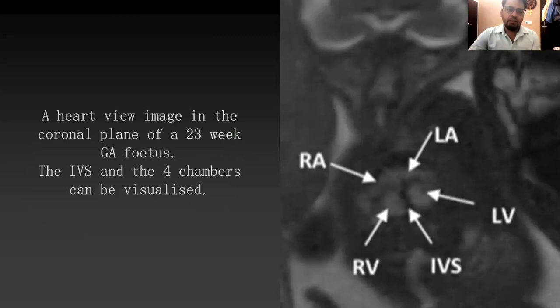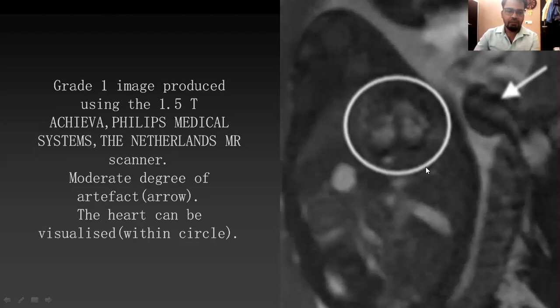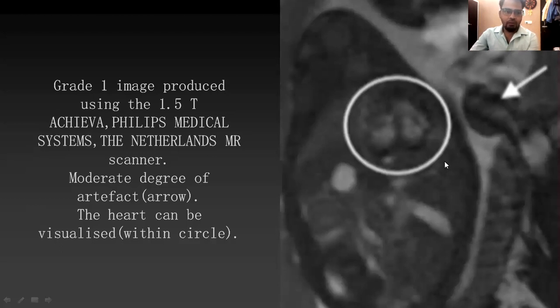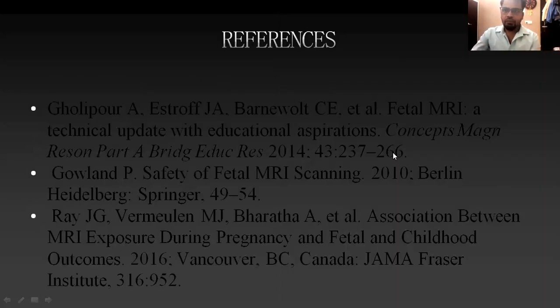The images from my study show a 23-week gestational fetus. We can see both atria, both ventricles, and the interventricular septum, which are pretty well visible. I have also shown a grade one image using 1.5 Tesla MRI, where the artifact is indicated by an arrow, and the heart is visualized within the circle. Thank you so much.